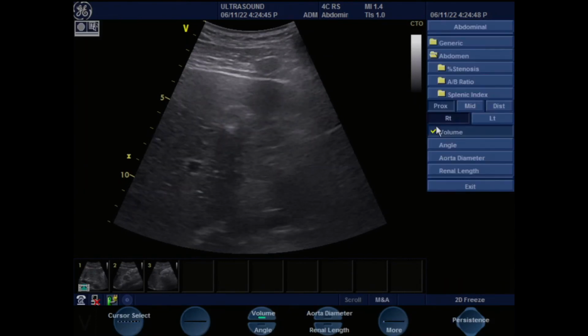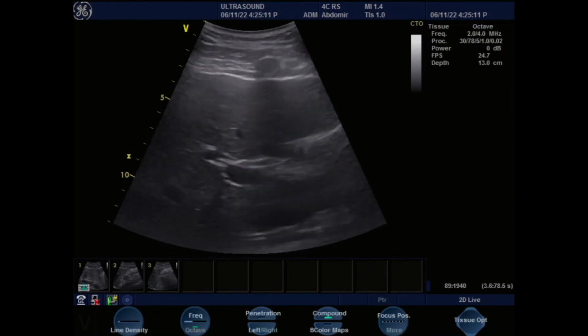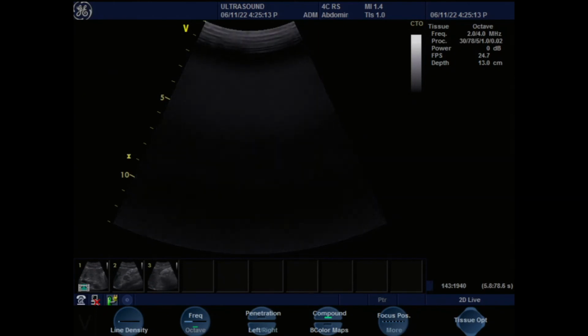So basically, this is the gallbladder. And you see, we can barely see the lumen because it's contracted. This dark line is shadowing from the rib. The rib is up top here, and because the bone is dense, it will absorb all the sound waves, and you'll get a blackout behind the ribs. So the goal is to try and scan between the ribs to get better pictures. Okay. You are welcome.